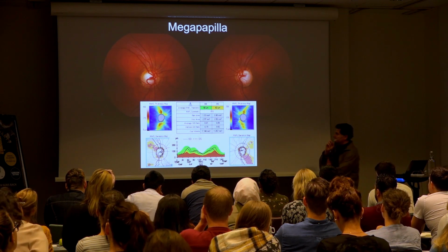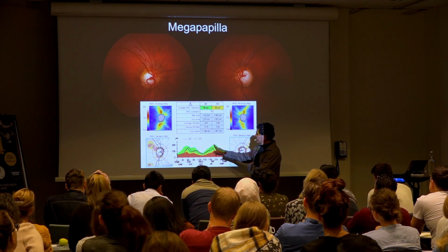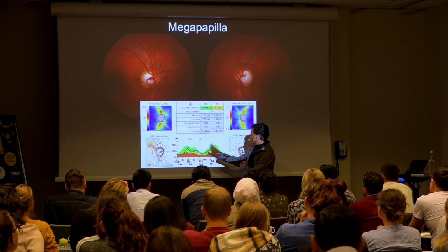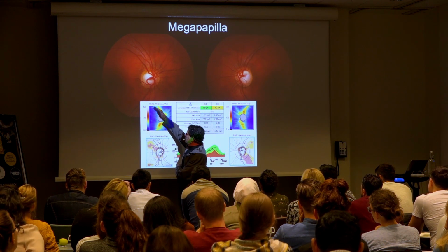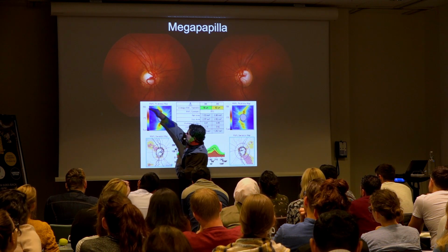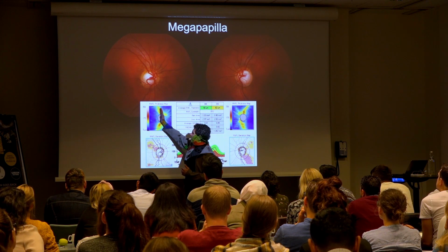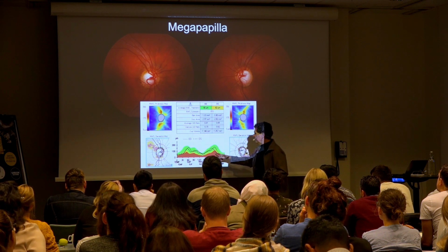Another interesting aspect, you're probably wondering, what's this? You see where the normal peaks are for the normal population, where they're located? The location of those peaks signifies where the arcuate bundles are expected, what angle they're supposed to come in. Normally it should be about right here. Hyperopic eyes often have an angle coming in more vertically, and myopic eyes often have it coming this way. So some people call this peak shifting.